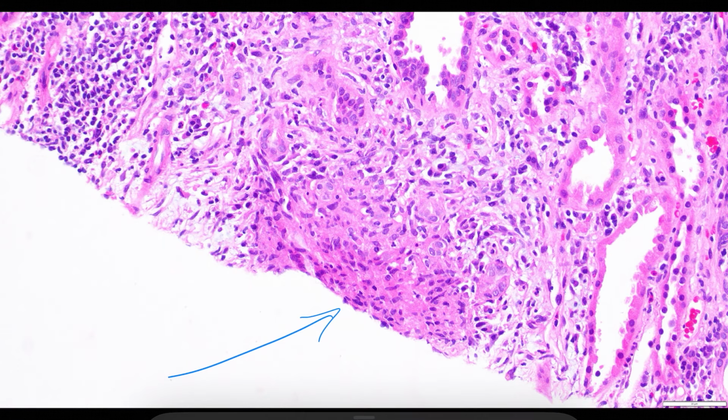Interesting. I usually think of checkpoint inhibitor nephritis as a lymphoplasmacytic-rich acute interstitial nephritis rather than a granulomatous interstitial nephritis. How often do we see a granulomatous pattern secondary to checkpoint inhibition? Good question. There isn't a lot of data on this topic, but a small case series from 2016 reviewed 13 patients with checkpoint inhibitor acute kidney injury, 12 of which showed the typical acute tubulointerstitial nephritis, with 3 having granulomatous features. So while it is not the most common pattern, it can occur in a subset of cases.